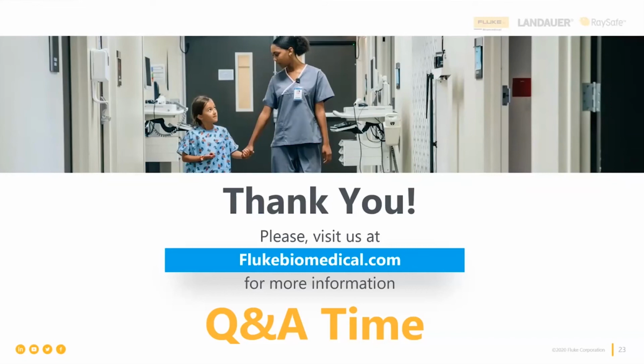And again, make sure you have the right protocol in it. Is it doing the right sequence that your hospital or facility has adopted? Correct. Those are the tests that I do on an AED to make sure that it's working right.